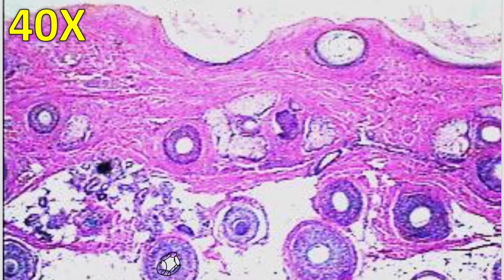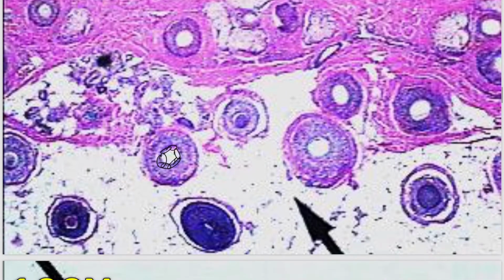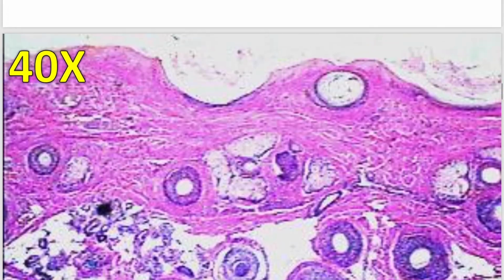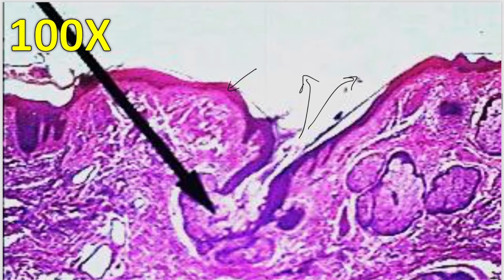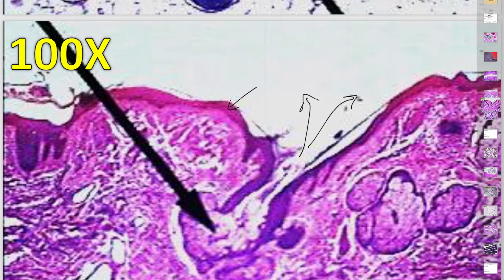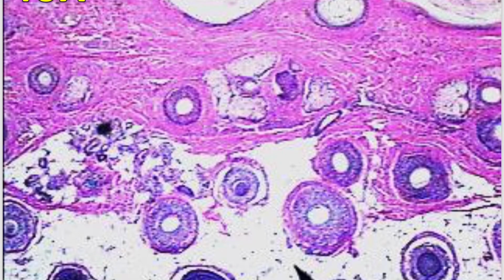So, all right, now what are you seeing here? This is the last one. I believe I have several slides. I probably have this and this on one slide. And apparently I have some writing already on it, so I'm going to erase that. We can kind of do that together. All right, so I'm going to erase this as well. So what you're actually seeing on this side is human scalp. So a chunk of your head skin, essentially.